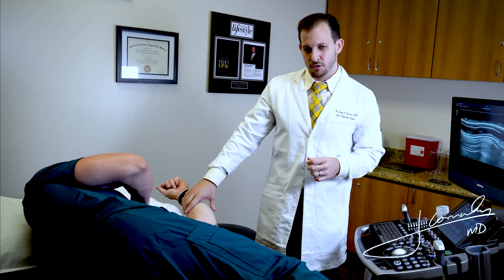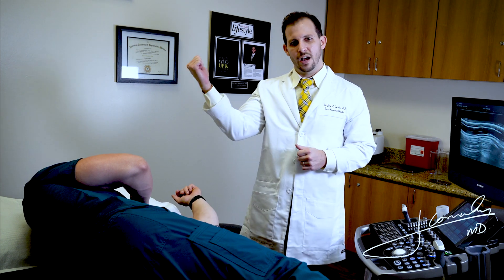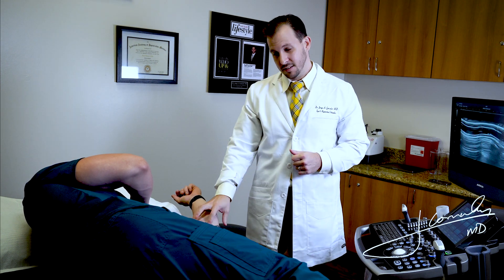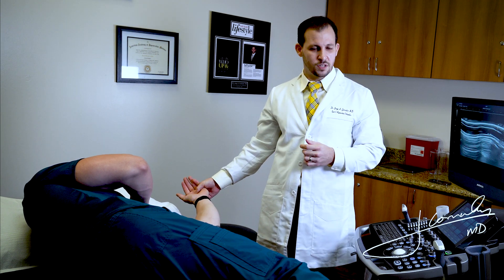Now, let's do a full diagnostic scan of the medial elbow, especially visualizing the ulnar collateral ligament. The first thing we're going to do is make sure we have our patient laying in the lateral decubitus position with the elbow flexed approximately 70 degrees. We also want to make sure the hand is fully supinated.